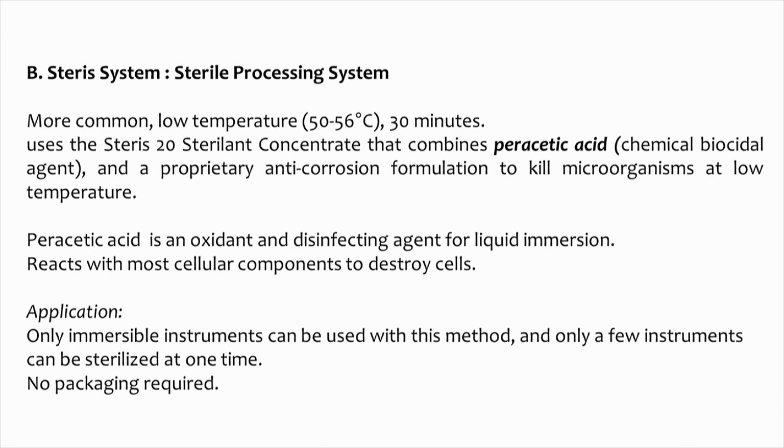Then we have sterile processing systems where we are using 50 to 56 degrees for 30 minutes. We use peracetic acid, which, as you know, is an oxidant and a disinfectant. So we can use this. It can kill microorganisms at low temperatures, so we do not have to go to 100 in an autoclave or 150 or something.